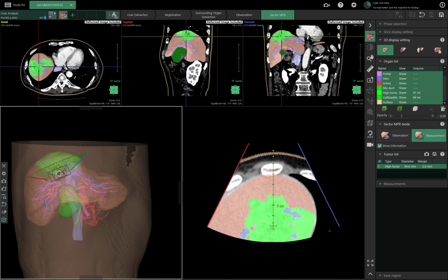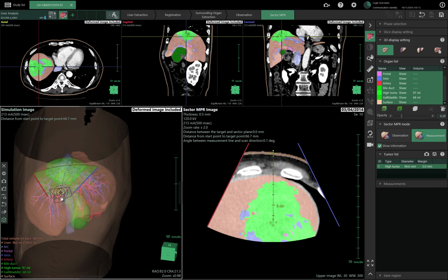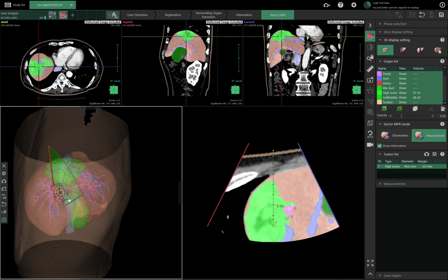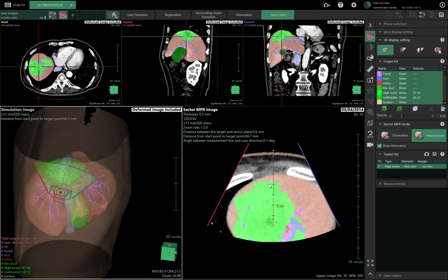But this is something for experienced surgeons. This is nothing that they will use at all. But maybe for some residents or some teaching purposes, this could be enough to show them where to locate the transductor and the orientation they need to have to get the kind of image they want in this visualization. Okay.